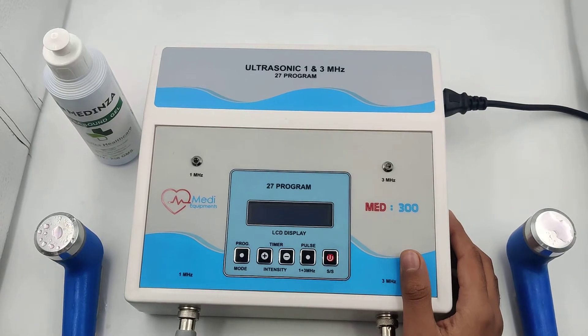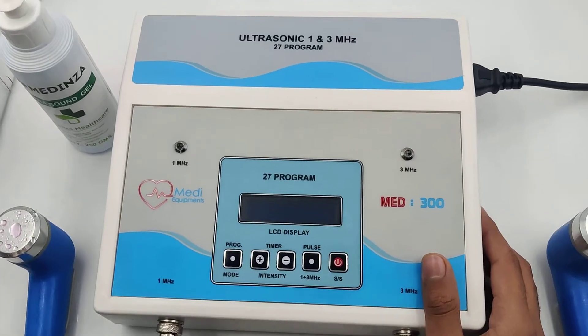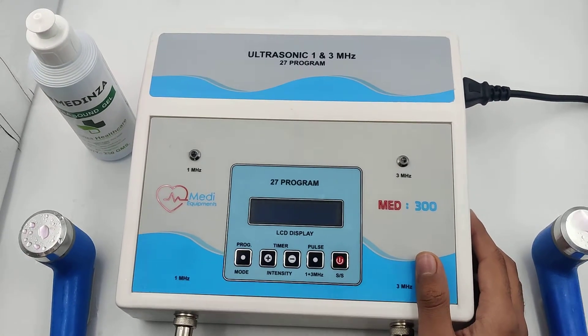I will show you the demo of the Med 300 1 and 3 ultrasound therapy LCD unit. It has inbuilt 27 programs along with a manual program.